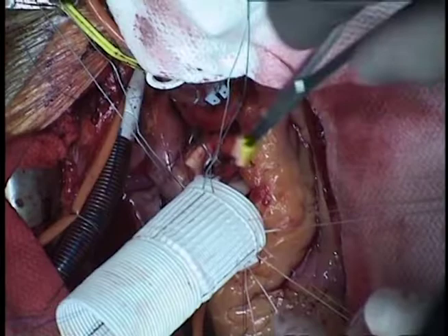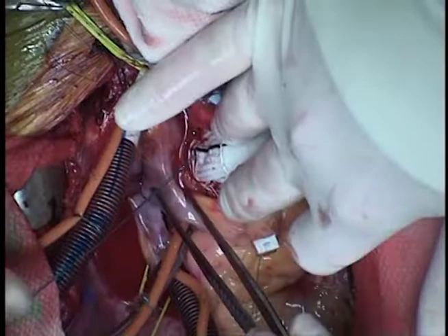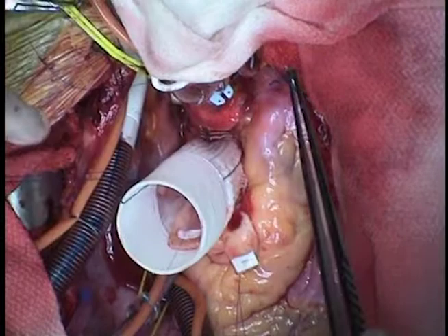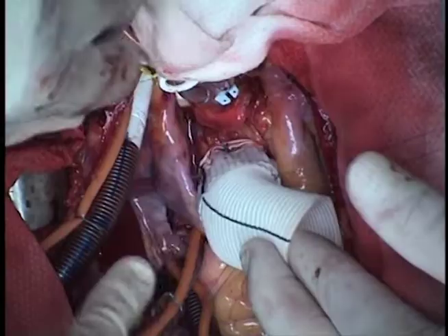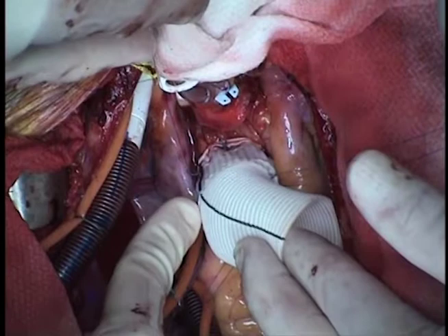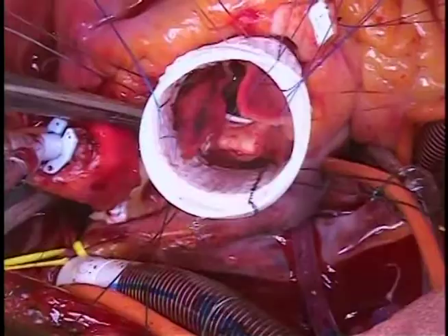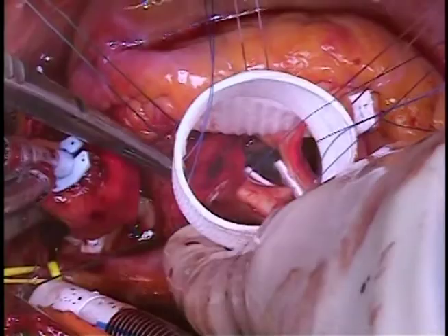We seat the graft carefully, pulling the pledgeted commissure stitches out through the middle of the graft one by one, being sure not to tangle them. We start by tying down all the sutures beginning at the nadirs. Once the nadirs are tied down, we then move to the commissures. You can cut your sutures as you go or use them as stay sutures to splay out the root for perspective.